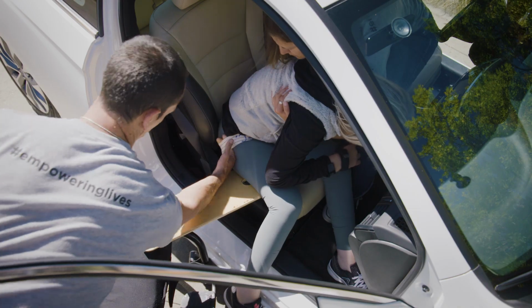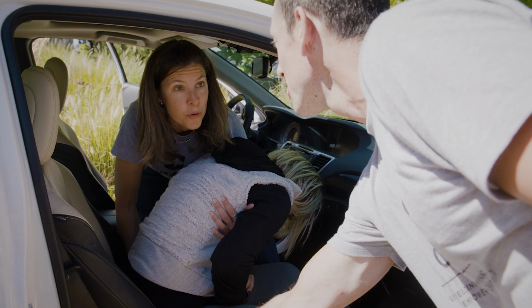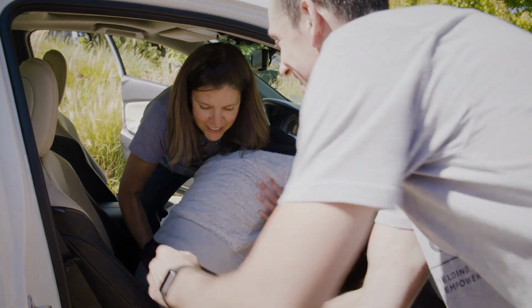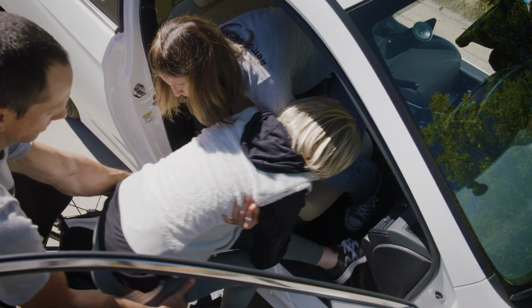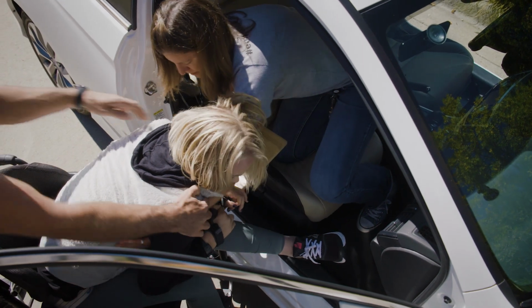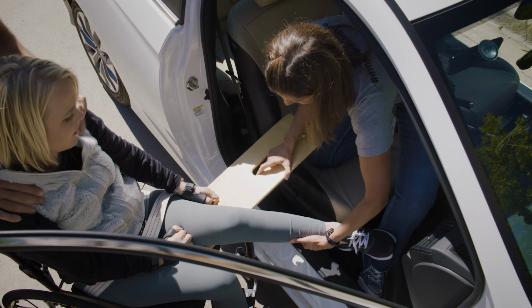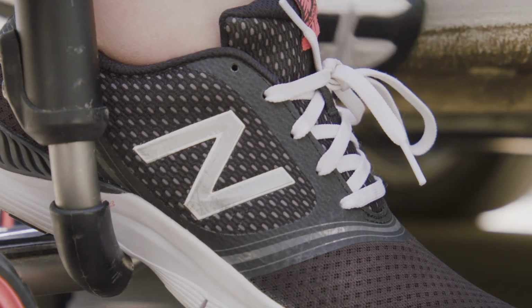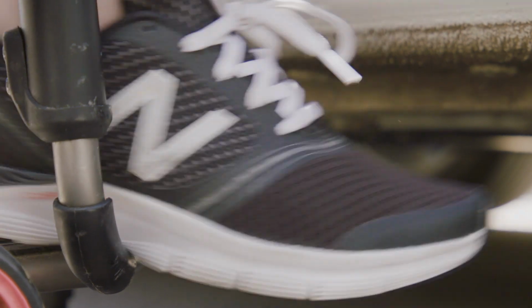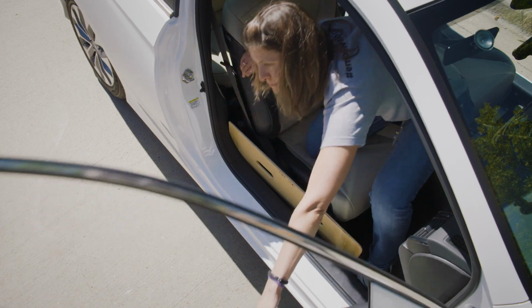Lean the passenger forward and use the lap belt rather than grabbing other areas. A countdown helps to coordinate the slide across. Make sure the hips are safely on the chair before the passenger's head comes up. Remove the slide board. Place the passenger's feet on the footplate and ensure that they are secure in their chair. Other adjustments can be made at a safe distance from the vehicle.